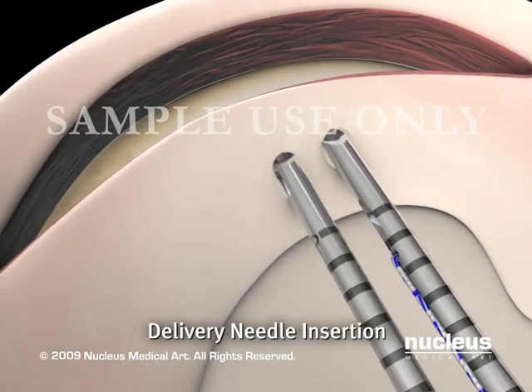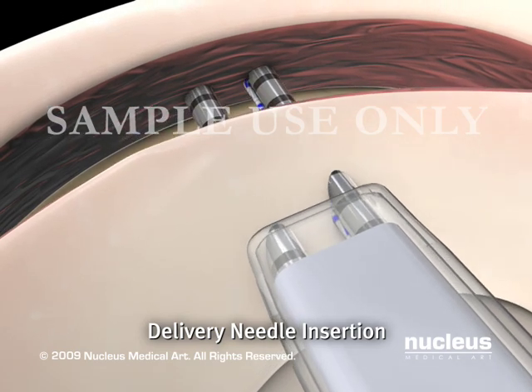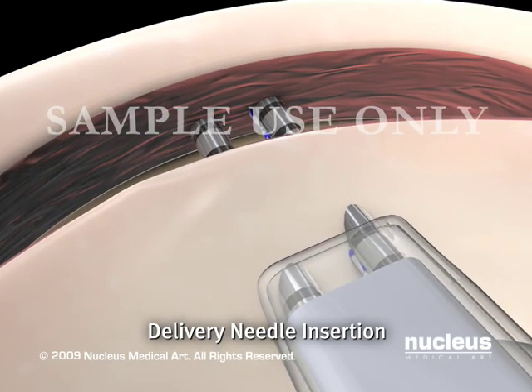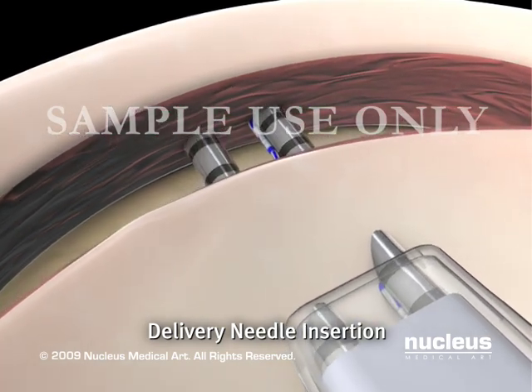The delivery needles are inserted into the meniscus, capturing the tear. The delivery needles will be in position when the depth limiter pushes against the meniscal surface, limiting advancement.